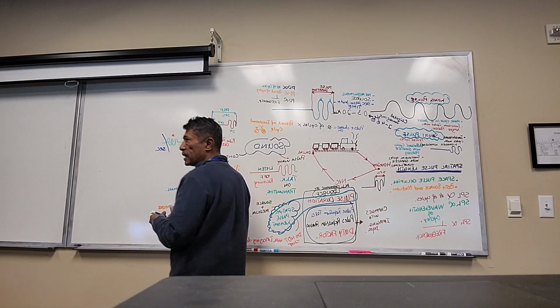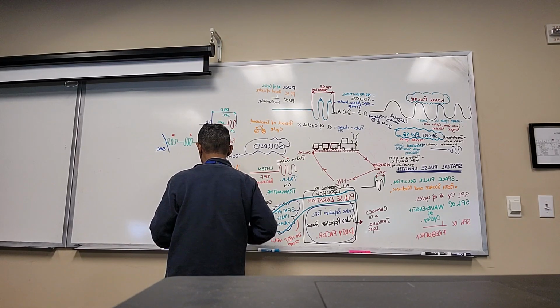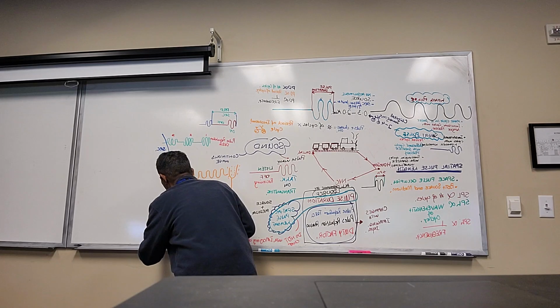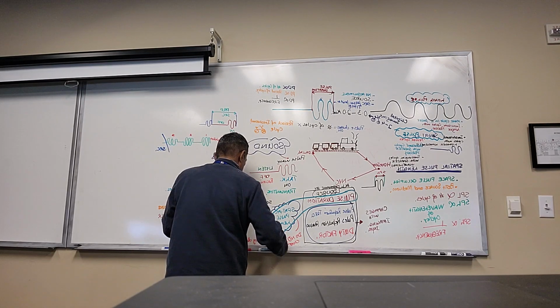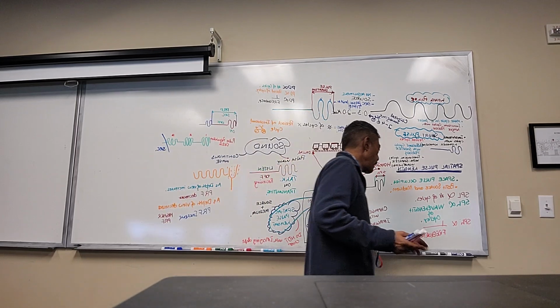PRF increases is another way of saying a higher PRF, less depth. PRF decreases is another way of saying a lower PRF.